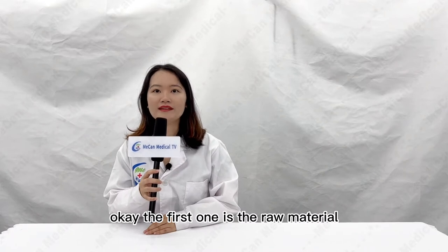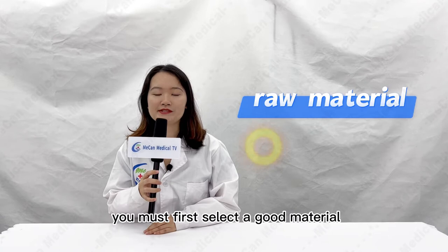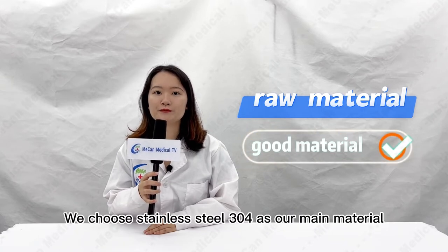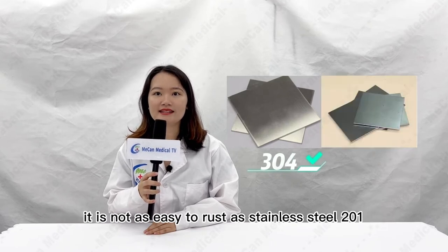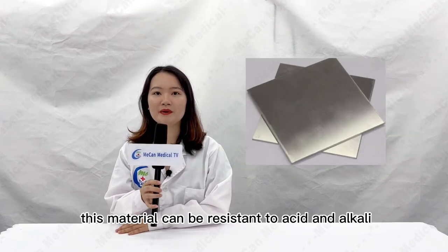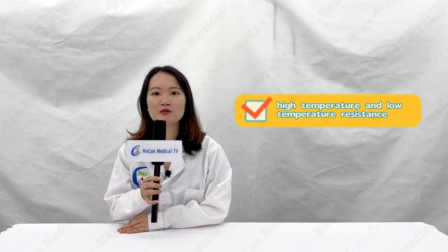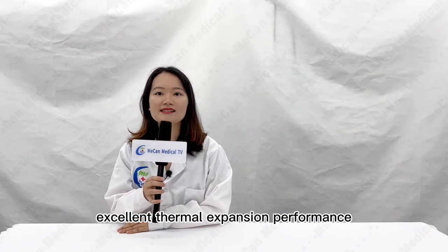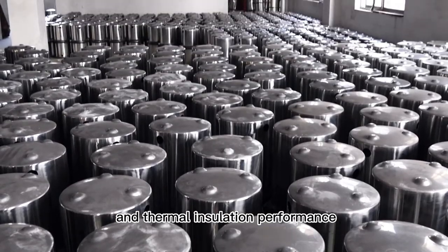The first one is the raw material. Before making a product, you must first select a good material. We choose stainless steel 304 as our main material. It is not as easy to rust as stainless steel 201. This material can be resistant to acid and alkaline, high temperature and low temperature, and oxidation resistance, with excellent thermal expansion and thermal insulation performance.